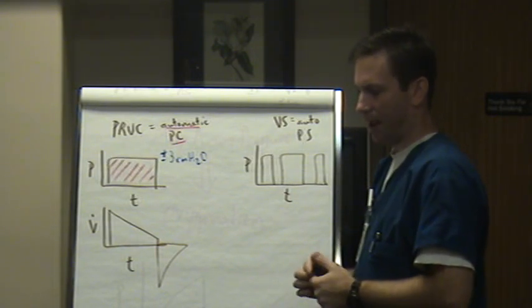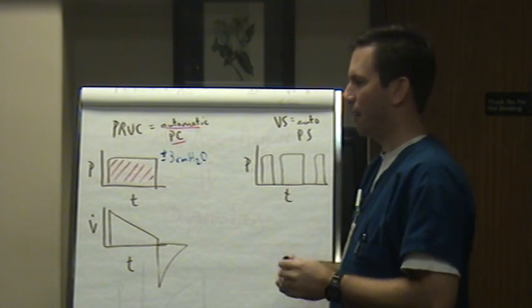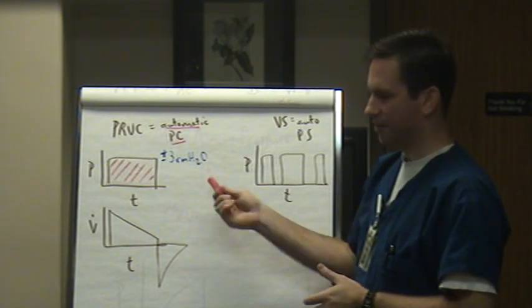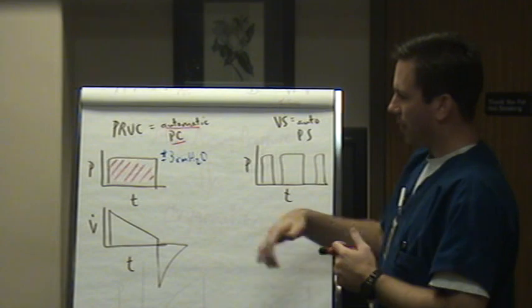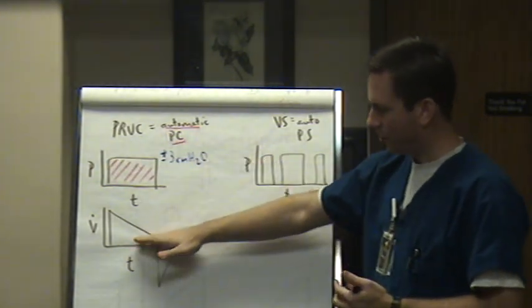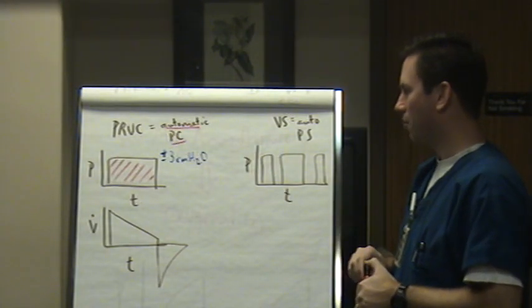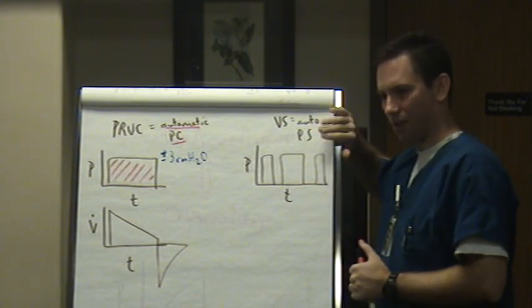If they're in volume mode, use that in combination with the peak pressures. We might suggest at that point that they might benefit from some sort of pressure mode. And in this institution, PRVC is the famous one that we like to go to. I just explained to you that PRVC gave you a volume guarantee, but it gave it with this gentle flow pattern and its automatic pressure control. Well, Siemens or Servo didn't want to stop with just PRVC. They said, you know what? Let's do it for a spontaneous breathing breath as well.